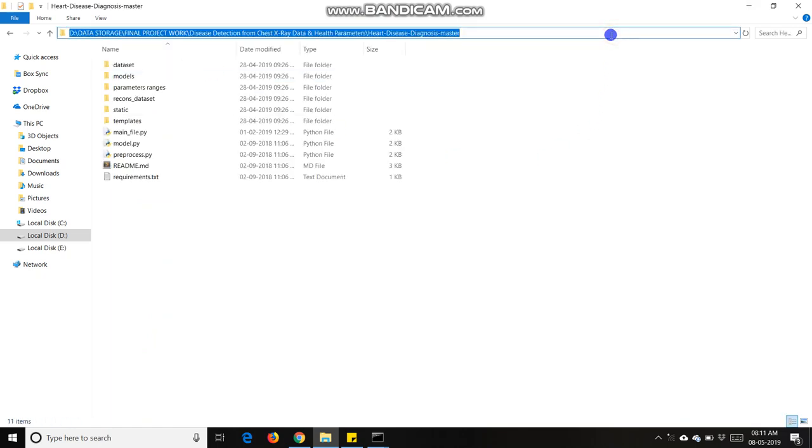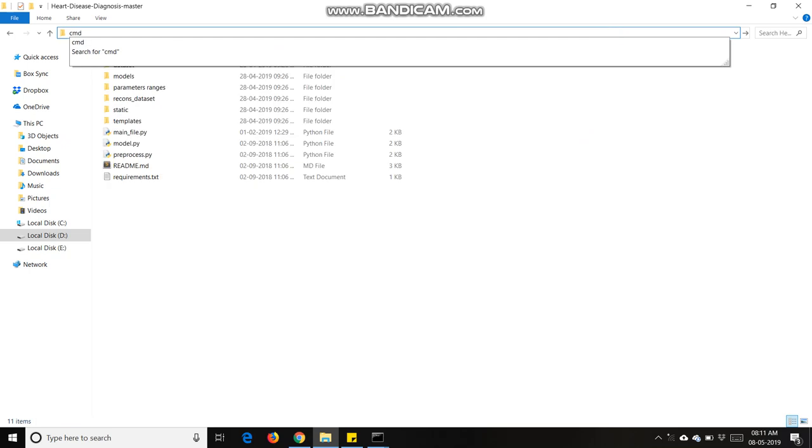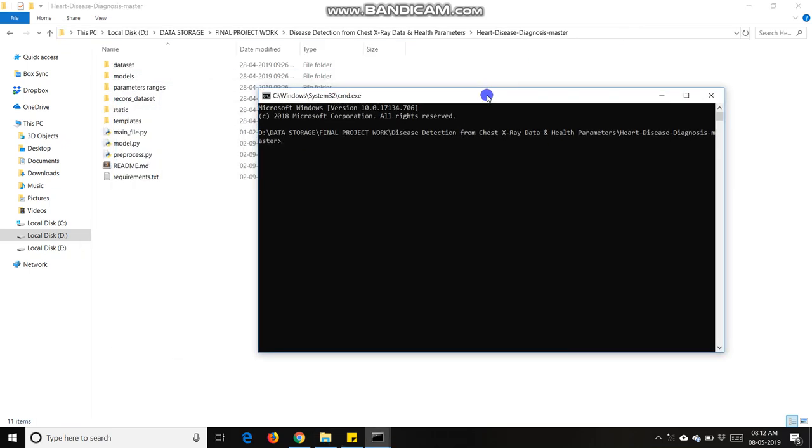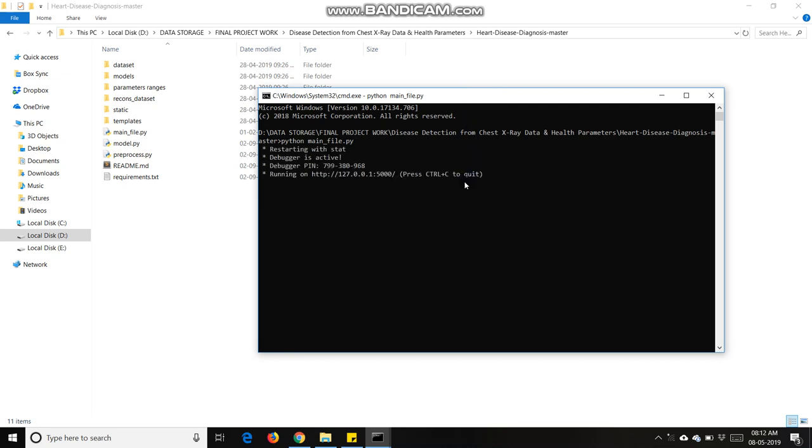I am going to start my project from command line: python main file dot py. This project is made in Flask technology. It gets started at port number 5000.